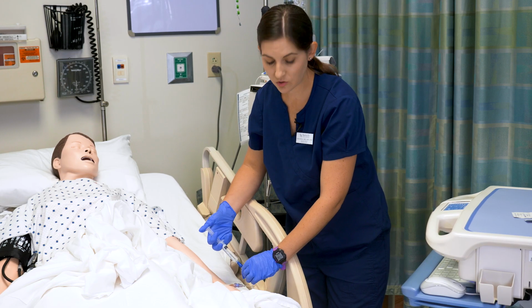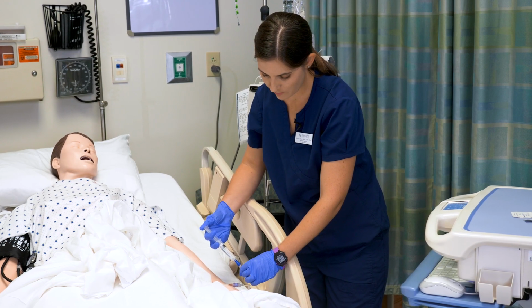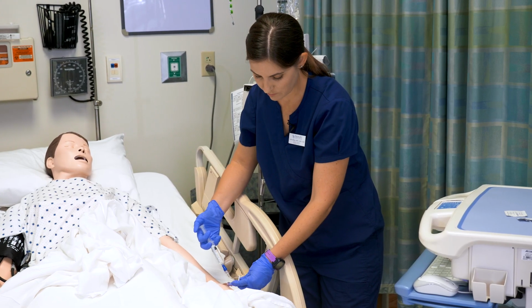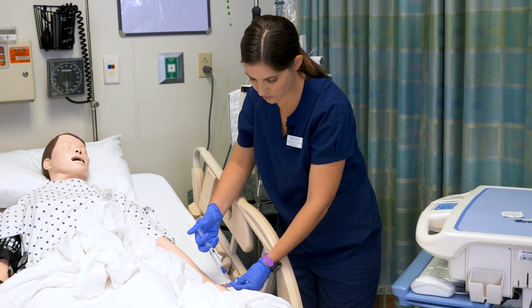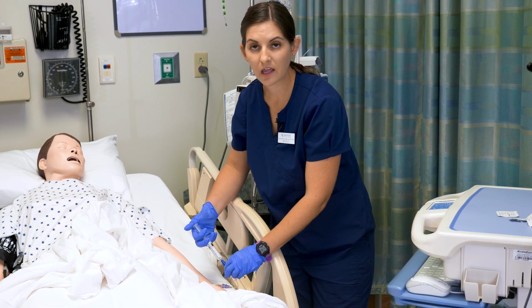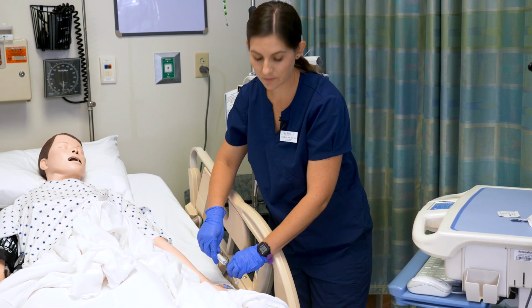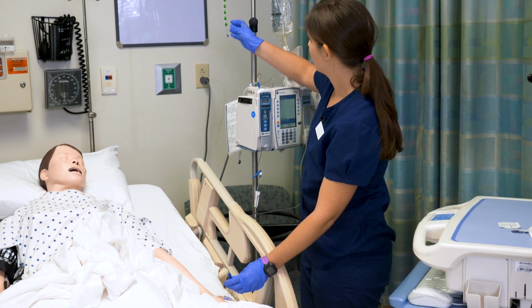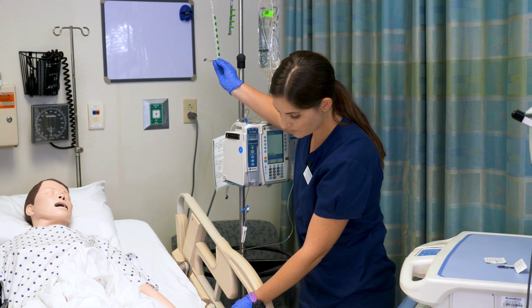These are negative pressure valves, so when I'm finishing my flush, I need to maintain pressure as I'm flushing, because if I do not maintain pressure as I'm flushing, blood can flow back into the catheter tip and occlude the IV line. I'm now going to go ahead and place a Curos cap on the end.